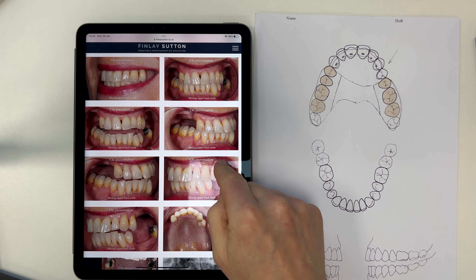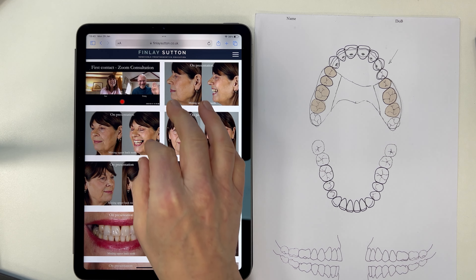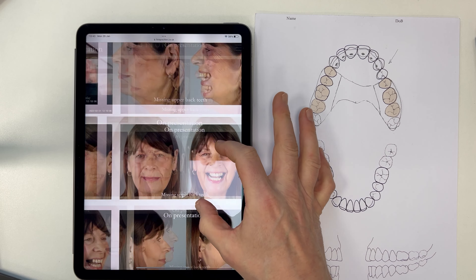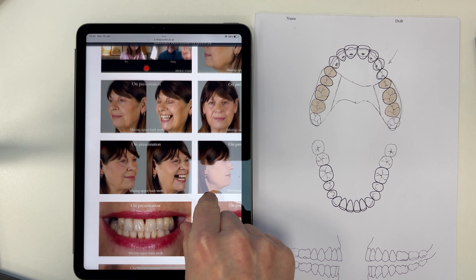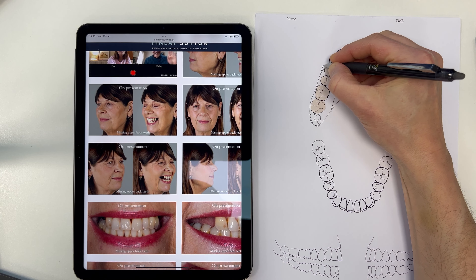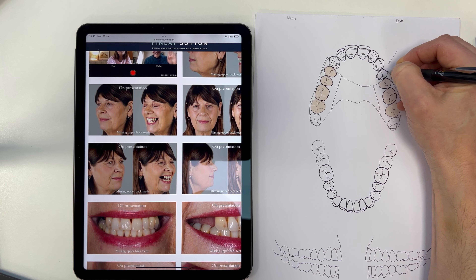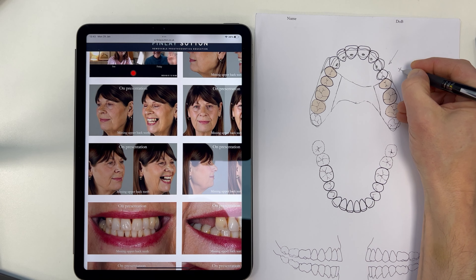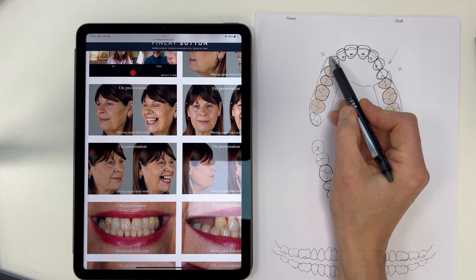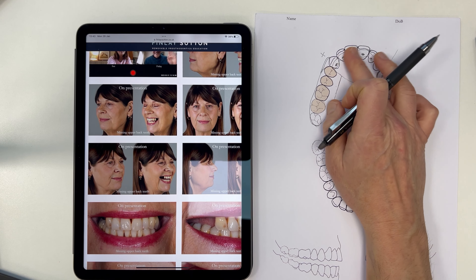Next I want to work out what we're going to do with clasping on these teeth. Looking at these smile photos is really important — I want to see what is visible when she smiles. When she really goes for it she still covers the top bit there, so I can use eye bars that come in off the top really nicely, keeping it right at the top of the tooth at the highest point. There's always an X on my designs indicating where the retention is. Generally on 90% of my dentures there will be two clasps per denture, with the gingival margin kept beautifully clear.